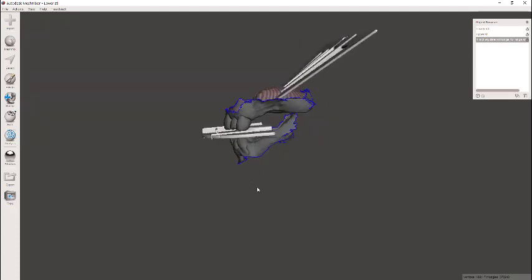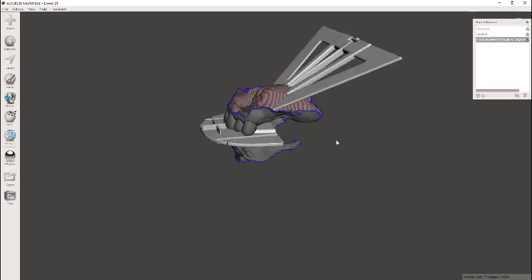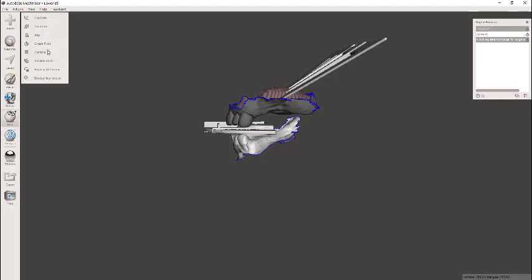And then remember, decide which model it is that you want to hinge. Okay, and we're going to have to join that. So you can do it with the upper or the lower. It doesn't matter. If you think about an articulator, it actually hinges the upper. It doesn't matter if they're both hinging from the same point, but I'm going to use the lower. So I'm going to go to the objects browser, control, and select both of those, combine them.